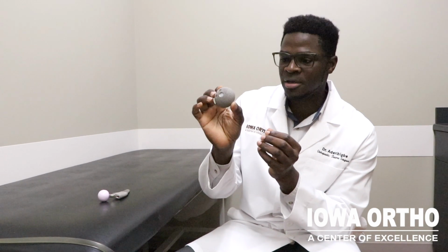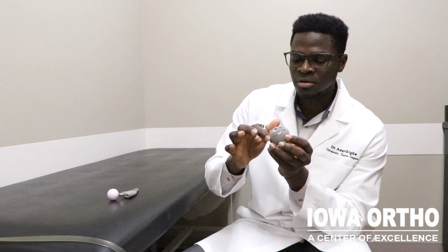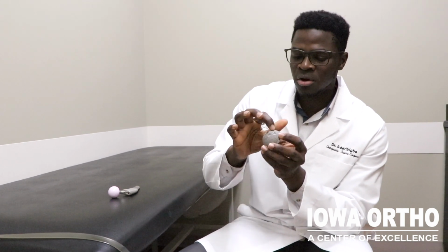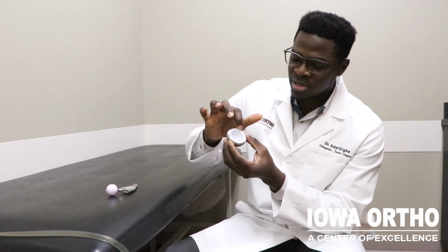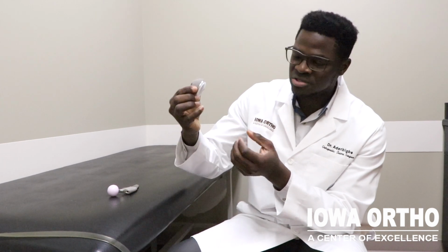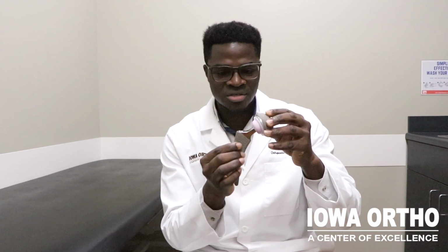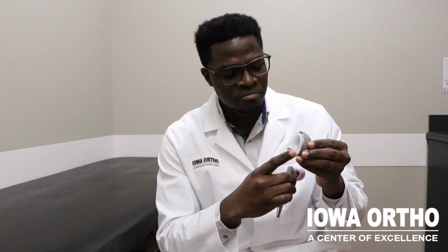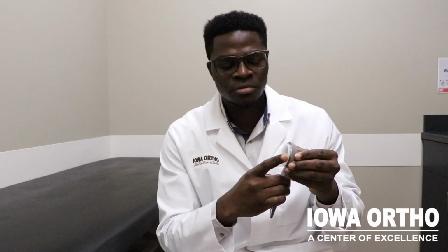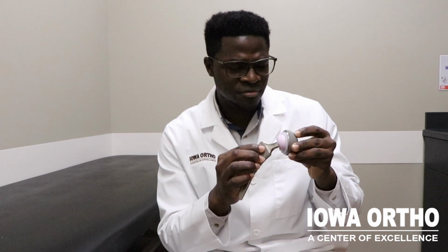We mill the hip socket and we put the shell. As you can see, the shell also has some rough coating where the hip bone grows onto, and also holes for supplemental screws. Most importantly, there's a plastic bearing that also locks into the shell, and that makes the socket component. So now when everything is combined, this is what we call a total hip replacement, and this is the actual implant that we use in surgery. The important thing to note is the plastic lining usually lasts anywhere from 30 to 35 years. A technically well done hip should last in excess of 30 to 35 years.